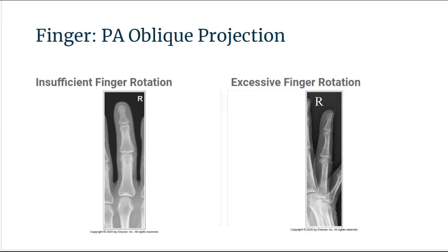In the case of insufficient finger rotation, the phalangeal mid-shaft concavity and soft tissue width on both sides of the digit are more nearly equal, meaning the finger was not rotated the required 45 degrees. In the case of excessive finger rotation, the soft tissue width on one side is more than twice as much as the other, and when one aspect of the phalangeal mid-shaft is concave but the other is slightly convex, that indicates the finger was rotated more than 45 degrees.